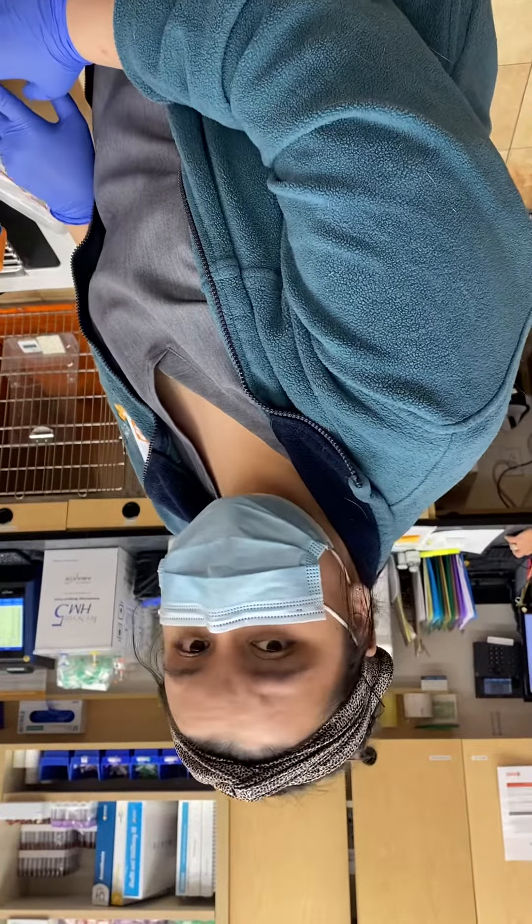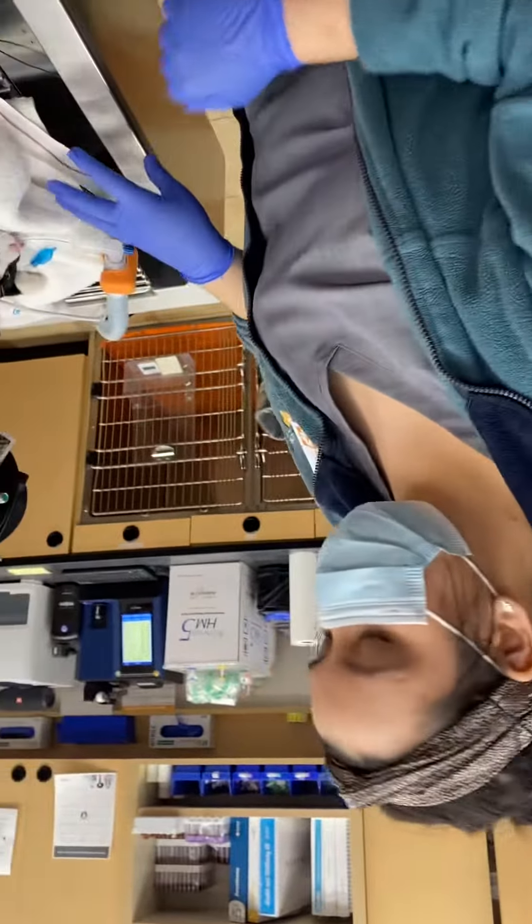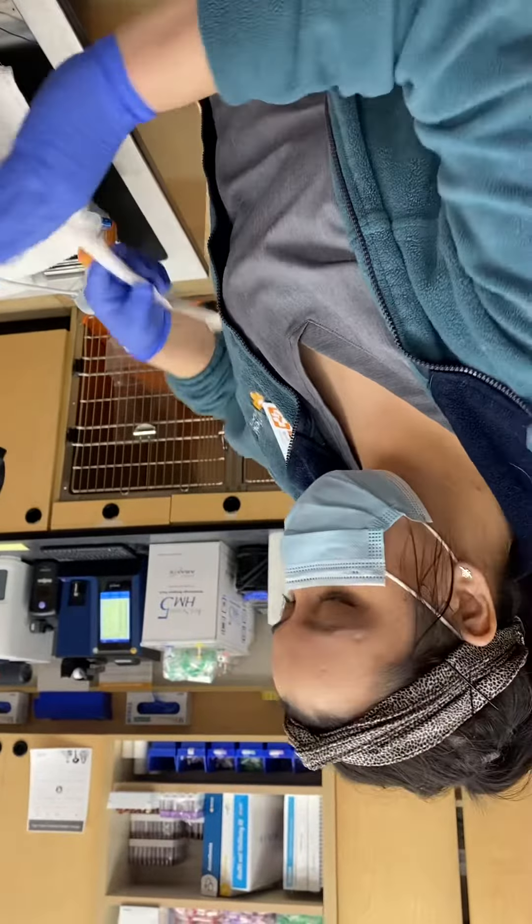Hi, I'm Zarina Islam. I will be doing an oral gastric intubation on this feline patient. We do not have a gastric tube, so I will be using a red rubber catheter.